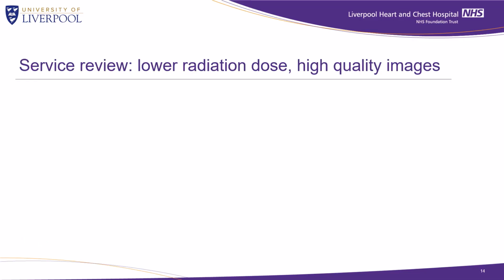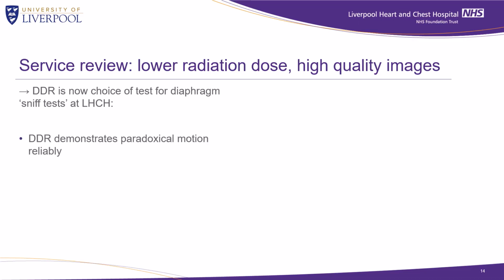We've now implemented a standard operating procedure to make DDR the choice exam for sniff tests at our centre. In a review of a couple of dozen cases, we found that DDR showed clear paradoxical motion in cases of paralysis, confirmed with other imaging modalities.